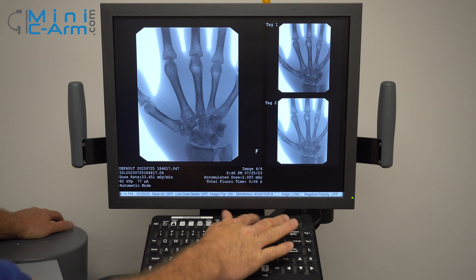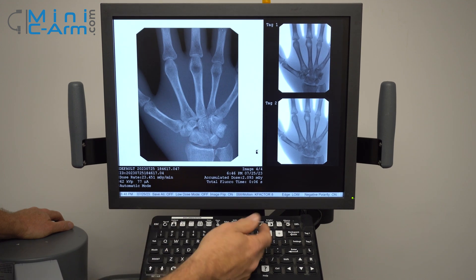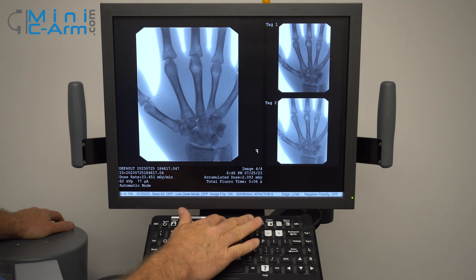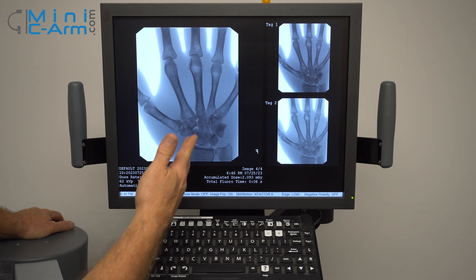You can also flip the image — it's just a toggle. Negate changes it to look like an X-ray. You can change the edge, which changes the bone grain basically. We usually keep it on low.